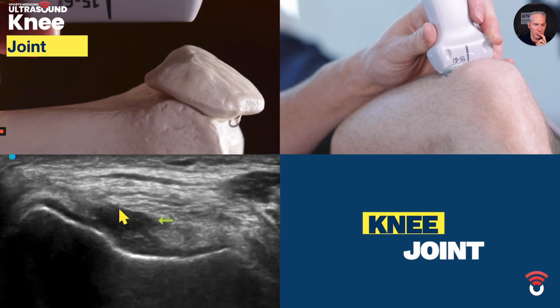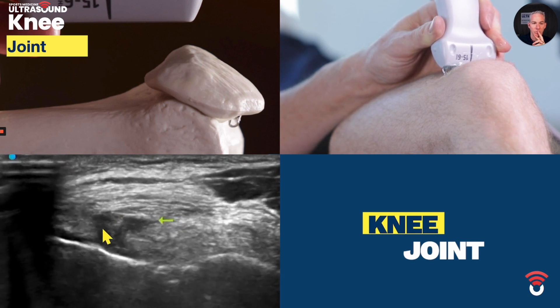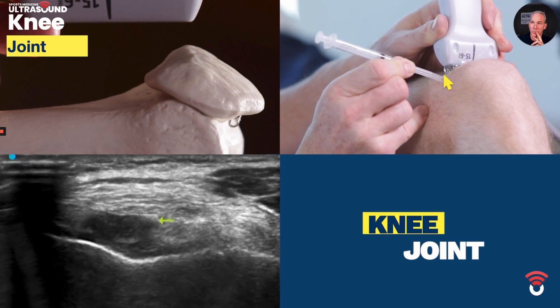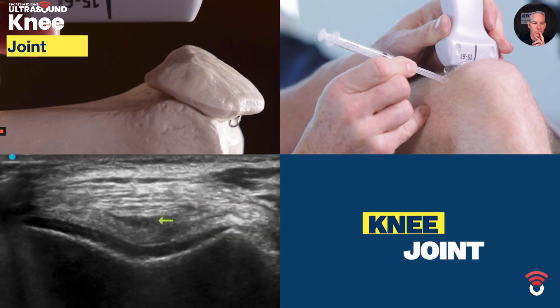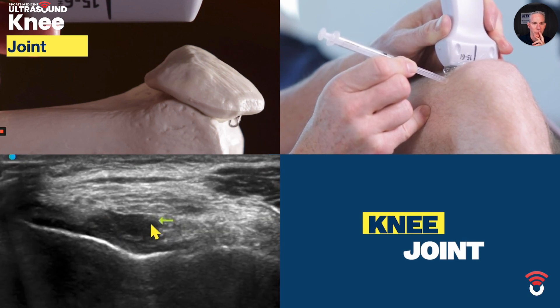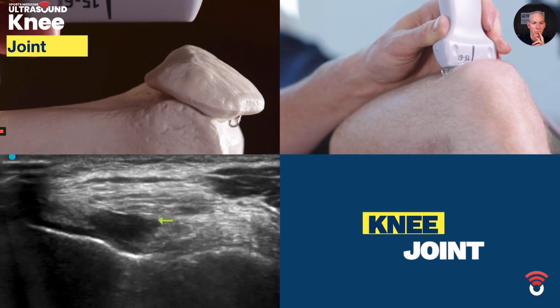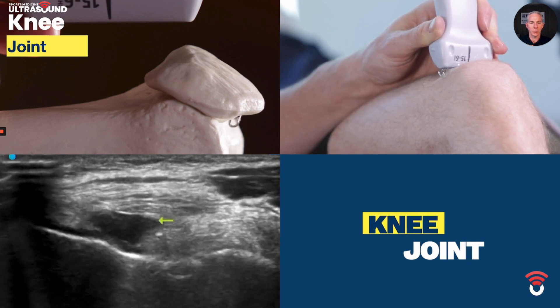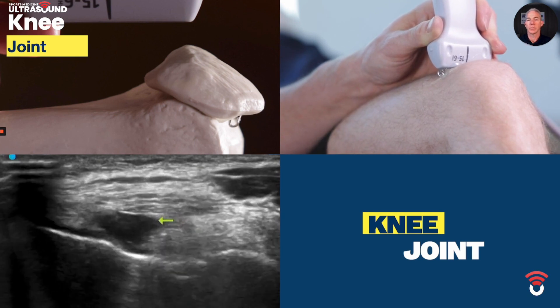To perform the injection I'm going to spin the probe 90 degrees towards me and I can see that hypoechoic area there. I need to toe in the probe just enough to be able to get my needle tip up and over the femoral condyle. My needle enters the skin just here and goes to touch the tip of the yellow arrow like so. This is a normal amount of physiologic fluid within the suprapatellar recess, and in cases where there's less fluid there's an alternative injection angle under ultrasound.